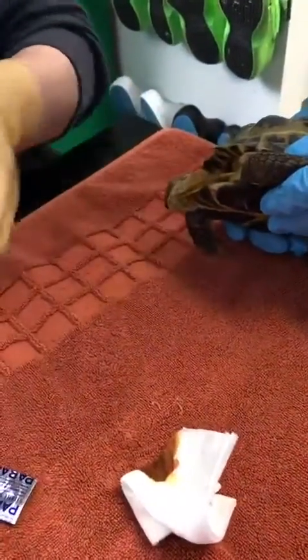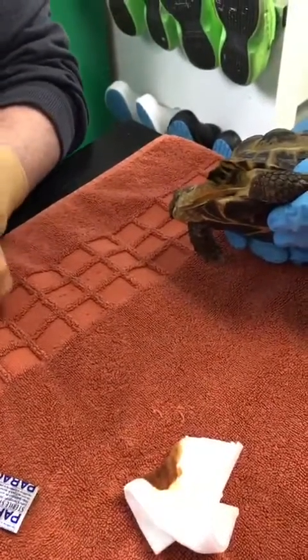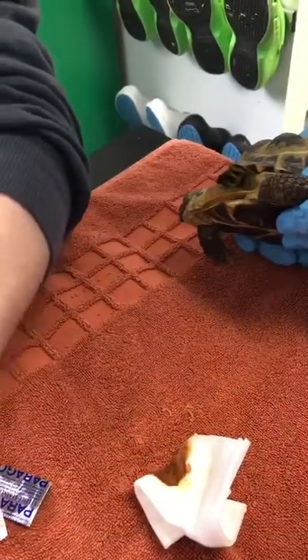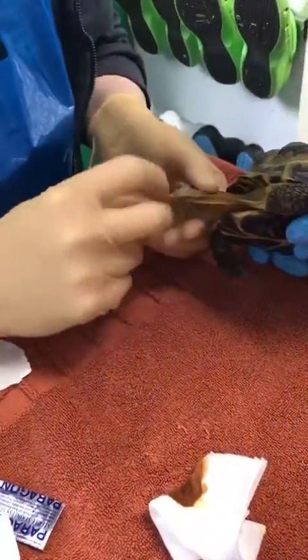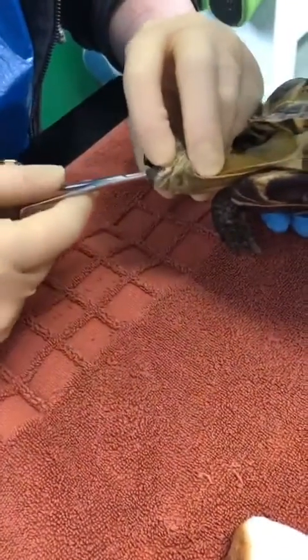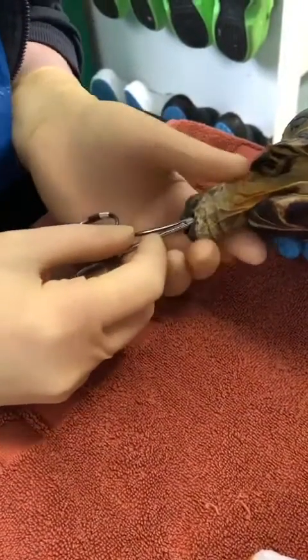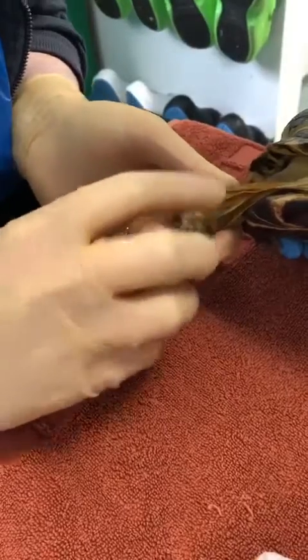We then want our artery forceps. I normally use a curved pair of artery forceps, just a small pair. We want to open the tortoise's mouth and pop them inside the mouth.